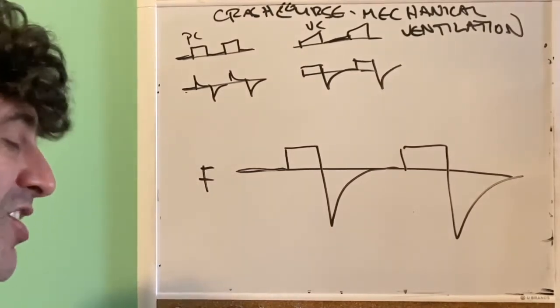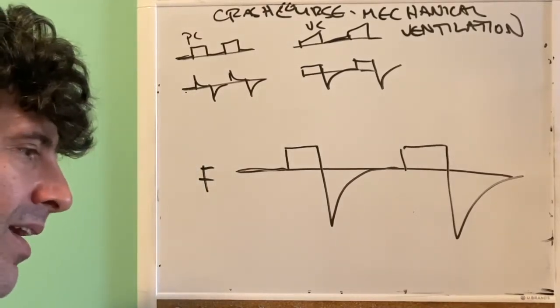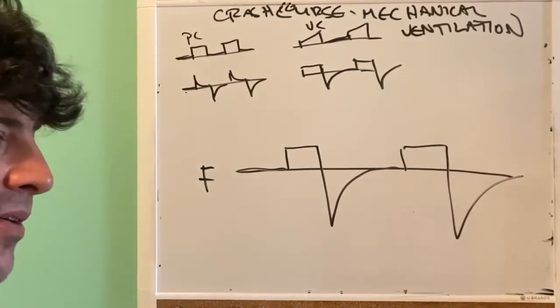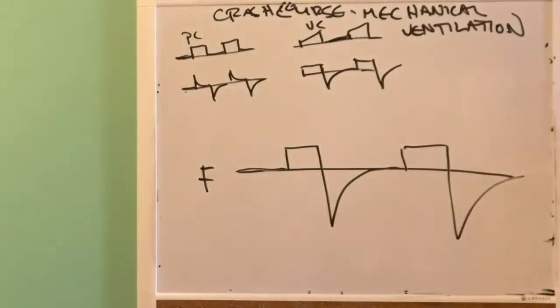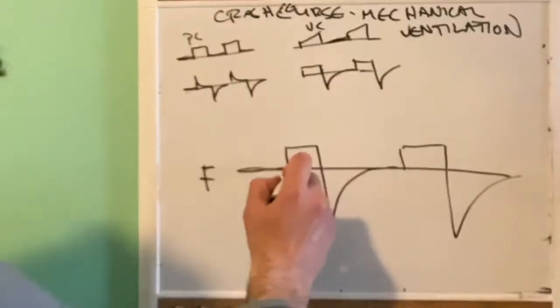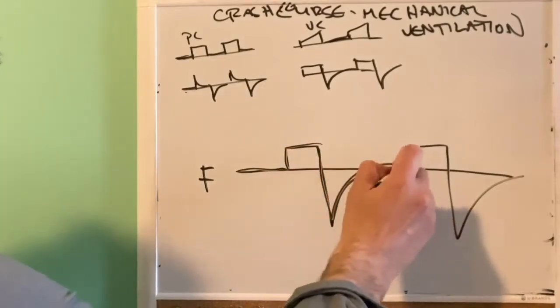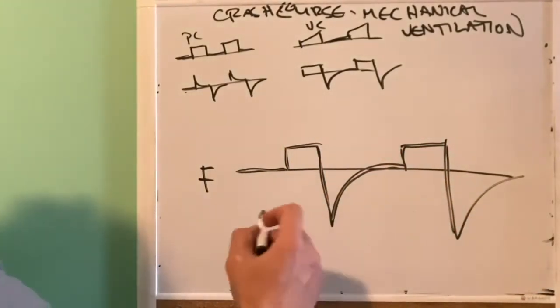All right, because the patient is using some of their musculature, or in some way is desynchronous with the vent, and they're causing pressure differences and flow differences. All right, and so in general there are 4 different parts of the breath in which one can have desynchrony, and this is not so important, but I'll name it just in case you hear it.